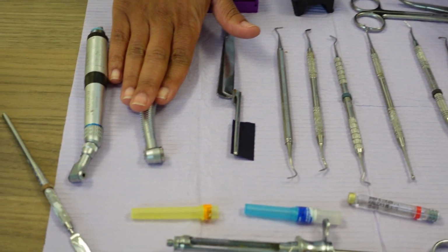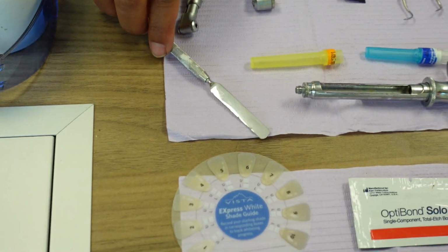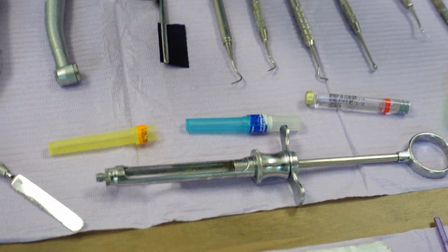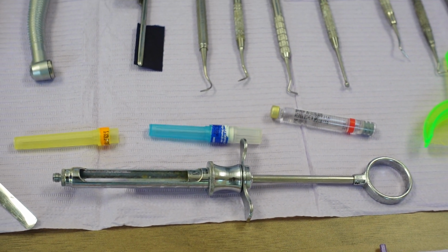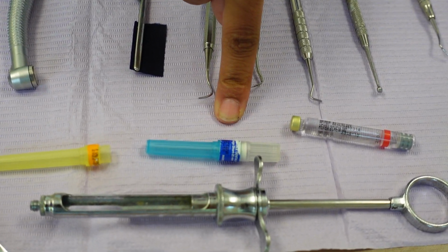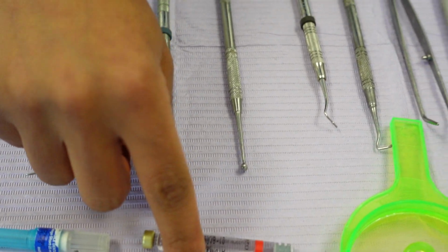We have our high-speed handpiece and our slow-speed handpiece, which we talked about earlier. We have a spatula here, which is used to mix material. We have our aspirating syringe that we also use to numb the patient. We have a yellow, which is a long needle, and blue, which is a short needle. Lidocaine has a red strip, that's how we know that's lidocaine.